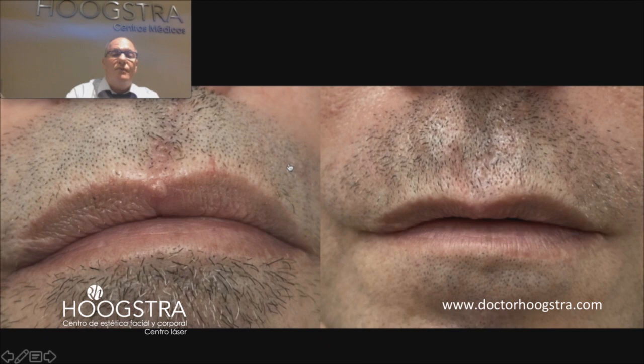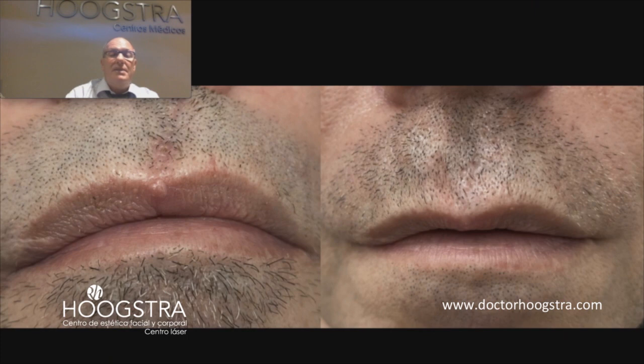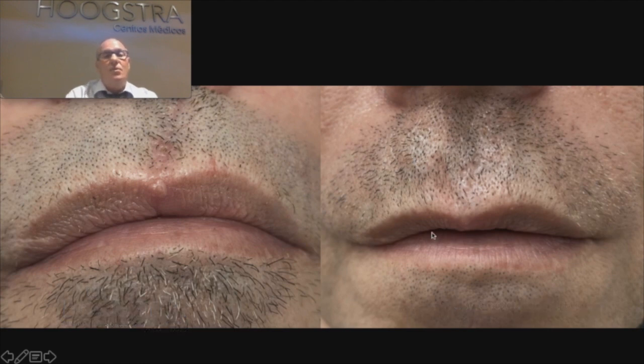I perform fractional laser. Here we can see the evolution. Here we can see how the scar has faded and almost disappeared, and how it improves after 2 or 3 sessions. The patient is very happy with the result, and just with a simple, safe, secure procedure and without downtime.